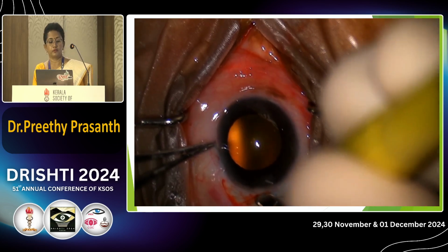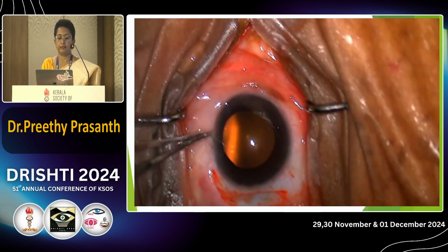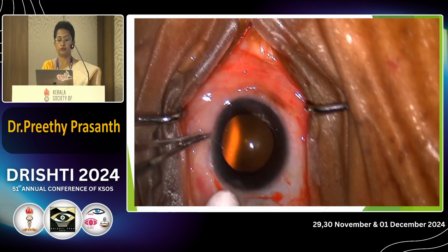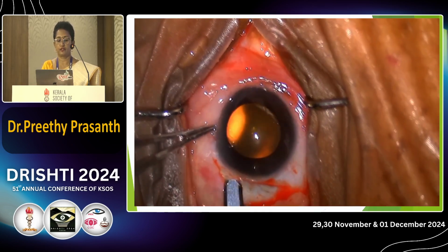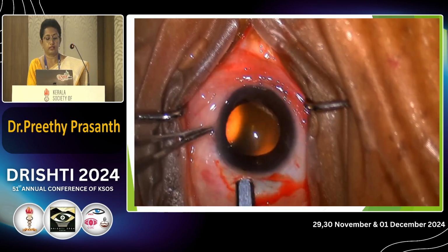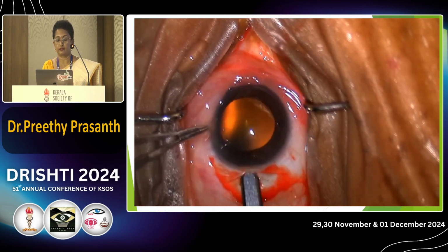After the globe is fixed with the fixation forceps, you can use either a blade breaker to do the grooving, or you can use the crescent knife itself for better control over the first grooving. Then you can tunnel through the stromal fibers with a wiggling motion.